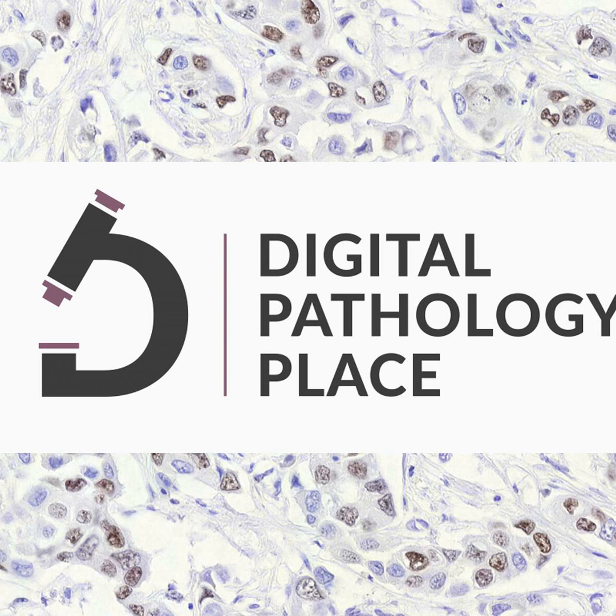And now you have a lot more, but most of them are still from the knowledge of when it came out, where we didn't have methods to restrict the hallucinations, like retrieval augmented generation, or fine tuning of a model, which is now part of the development process. And I call it consumer AI. It's implemented as it's being developed.